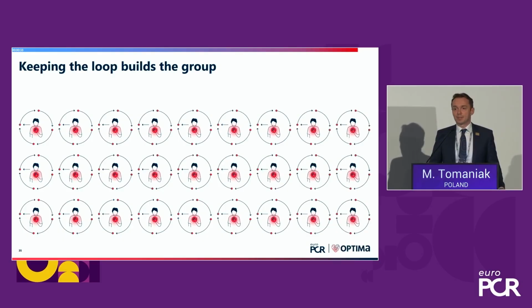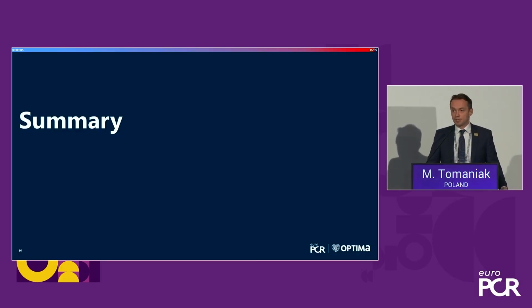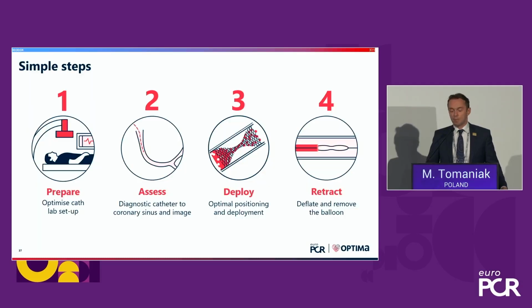In other words, it's not just between us interventional cardiologists to do a fancy procedure. We do need to keep in the loop of information all these general cardiologists and even GPs, to encourage and to reach out to these patients who are not infrequently consulted for several months or years for angina, that things have changed, and now we have a device that can be safely and smoothly implanted using this four simple step approach.